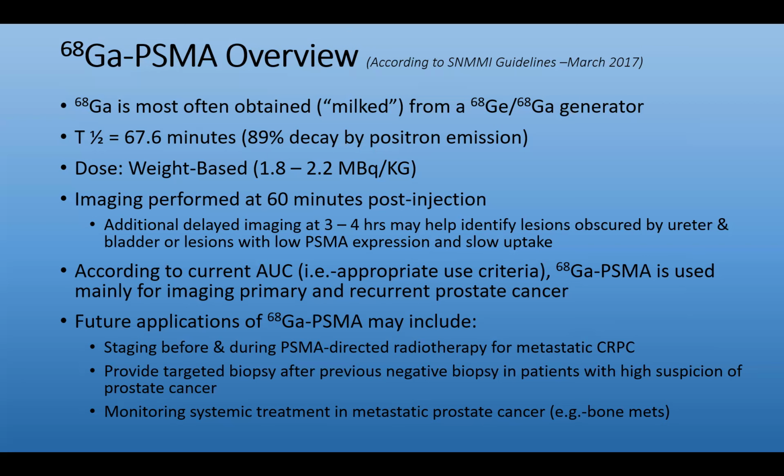We may also be able to use it to provide targeted biopsy after negative biopsy in patients with a high suspicion of prostate cancer. So this is when they might go in and put a needle in and try to get a tissue sample in order to determine if a patient has prostate cancer.